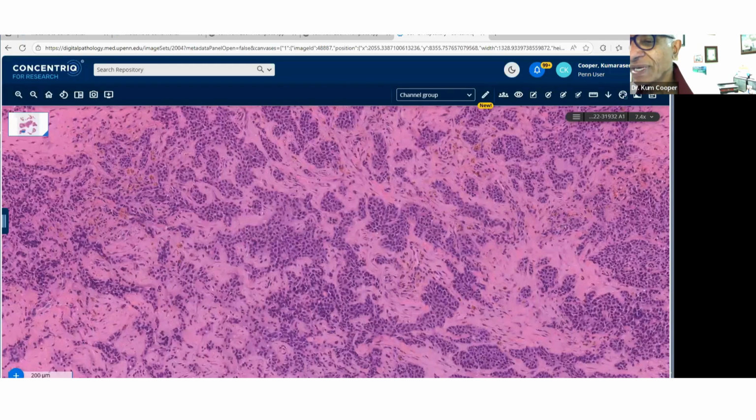Okay, we are going down the list here now. I've got PEComa here as well. And again, I said actin was negative. It's one of my screening tools for PEComa. So I'll tell you that was negative. And then desmin also is negative. So just to get that out of the way for the PEComa. But that's a good thought. I like that PEComa start there as well.